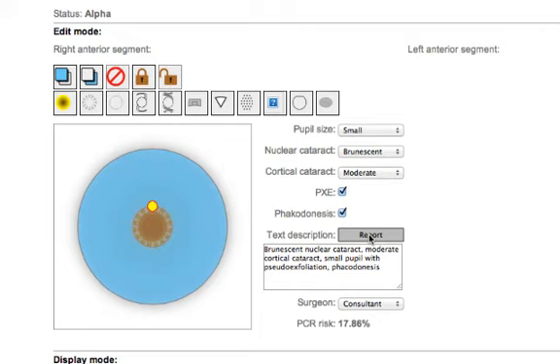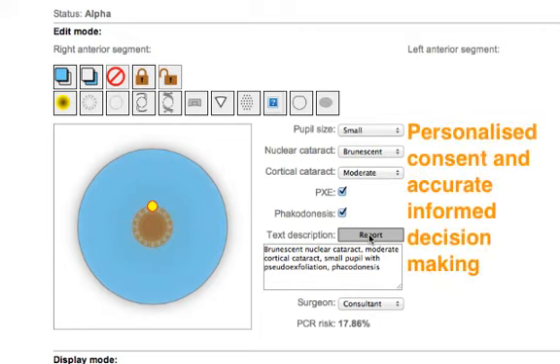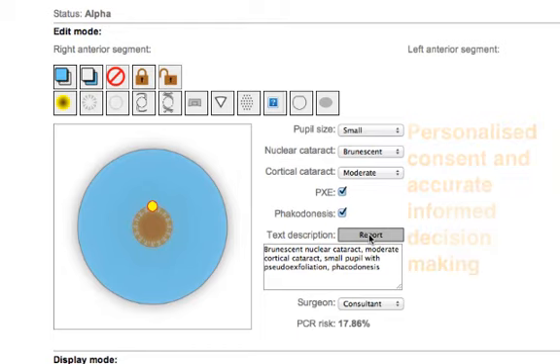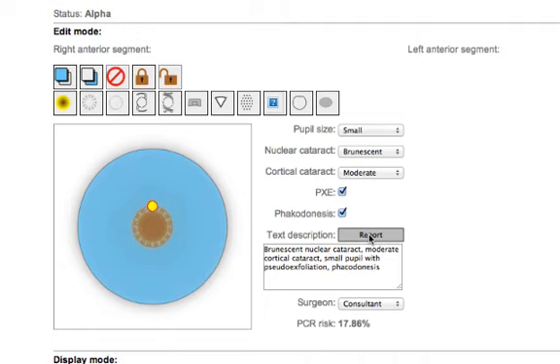Repeat it again, still a high risk but it's down to less than 20%. Using this tool you can give the patient much better information to consent them and also put that particular patient on an appropriate operating list with a very experienced surgeon so that their individual risk is reduced.